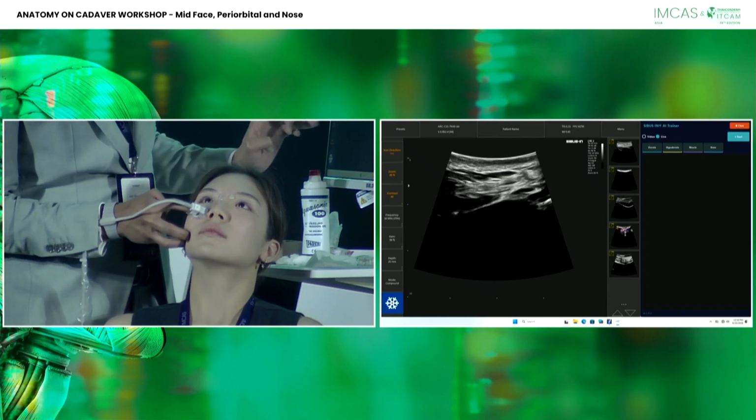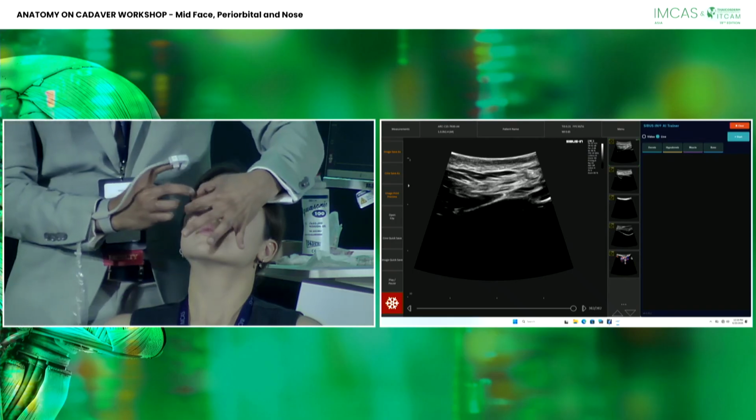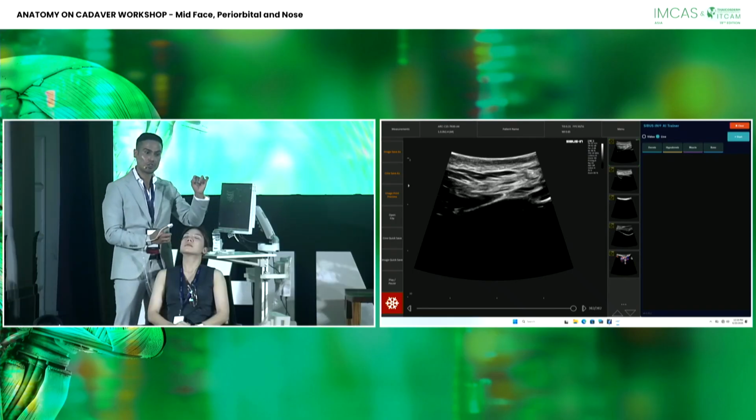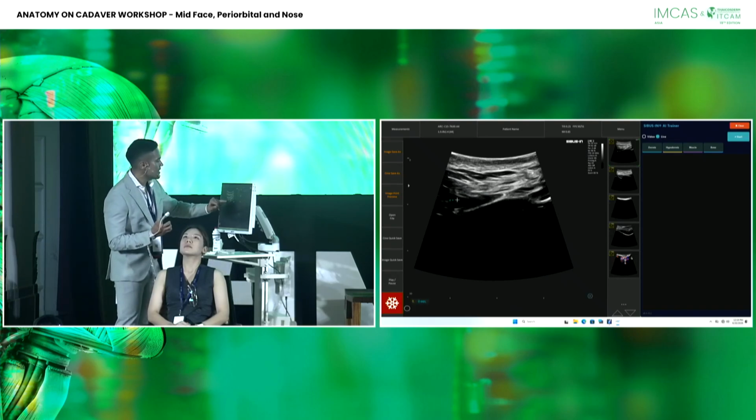All that information is what you want to gain out of this injection. And if you have a look at this position here, I again go in, have a look, after I inserted my injection instrument and I reassure myself where I am placing. I want to see my needle or cannula at this level, so on top of the bone at the level of the deep fat, what we call here the deep fat in this area.